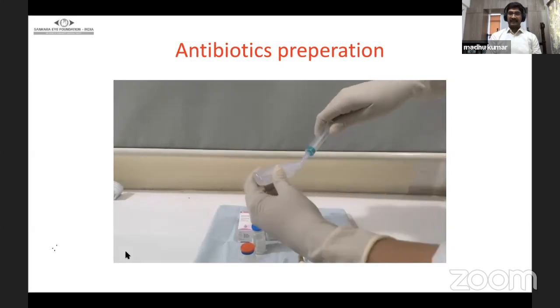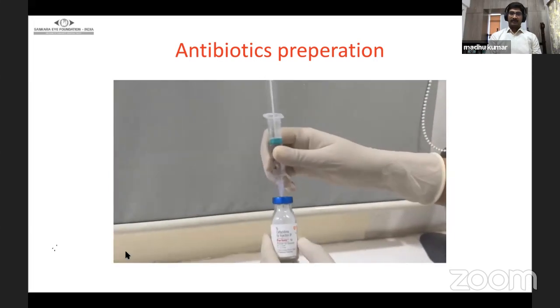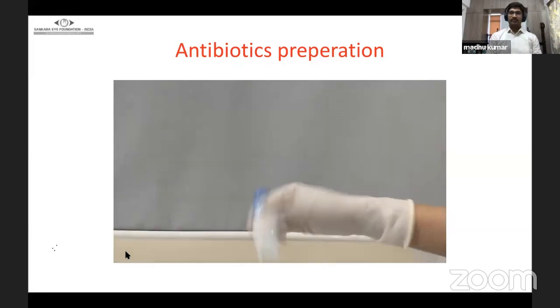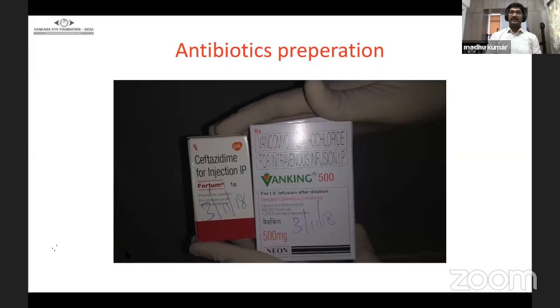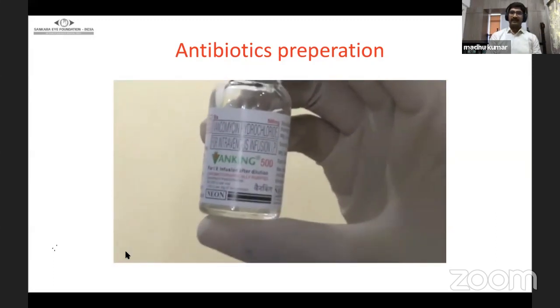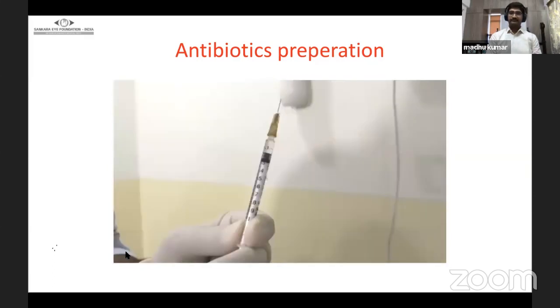Inject the saline as recommended by the manufacturer into the vancomycin powder. And then we need to shake it vigorously to make sure that the drug gets dissolved well. And we need to make sure that the date is mentioned on it. Usually it is recommended to use a fresh vial for every case. But sometimes these drugs can be used for up to 1 week and not more than that.